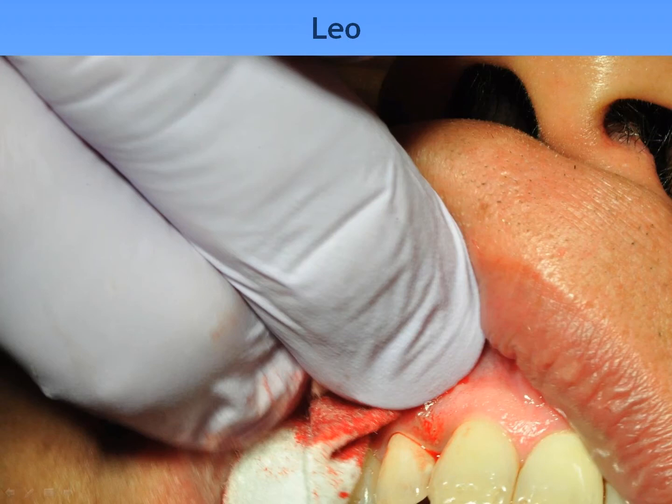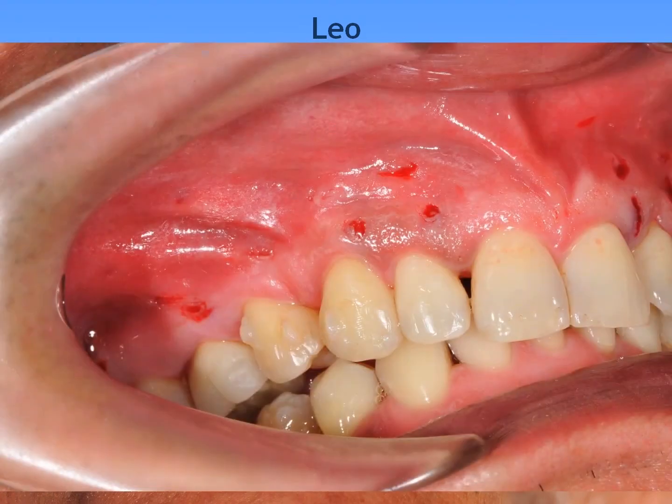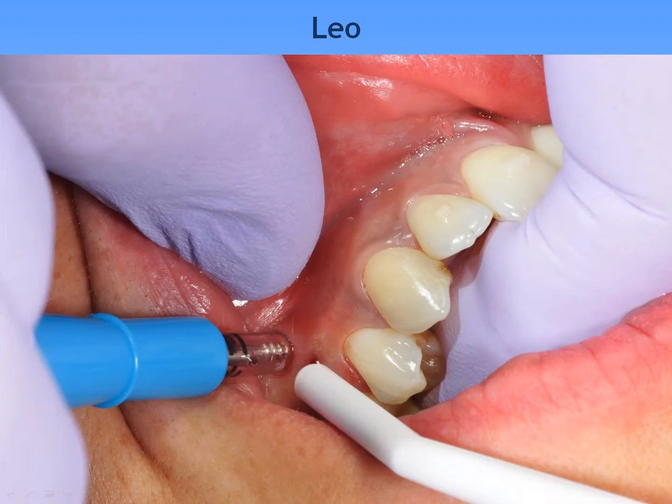If you put a little pressure on right afterwards with the wet gauze, it stops almost immediately. I'm going to show you kind of the worst case scenario there and how it looks after you've just wiped it and let it dry. Those are the perforations that we placed in his case. And sorry, I've got to repeat on these slides here, so as soon as my computer speeds up, we'll jump through them.